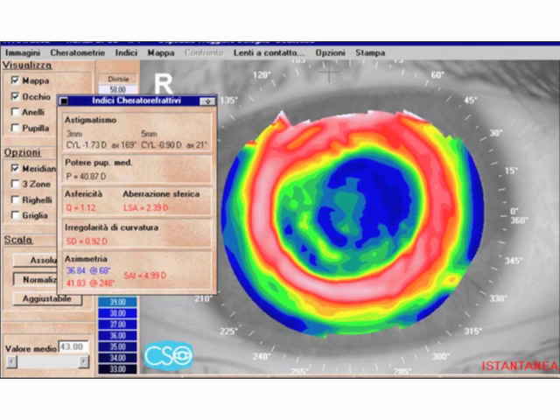What about this cornea? This is an interesting cornea, right? So this cornea has in the mid-periphery an area that is very steep, and in the center an area that's very flat, and in the periphery an area that's very flat. So what's going on with this cornea? What do you think? Well, you could say, could this be radial keratotomy? Because radial keratotomy produces mid-peripheral steepening and central flattening. I credit you. That's a good thought. I'm glad you suggested that. But no, this is an intrastromal ring, and the cornea is steep at the area of the ring and flat centrally.